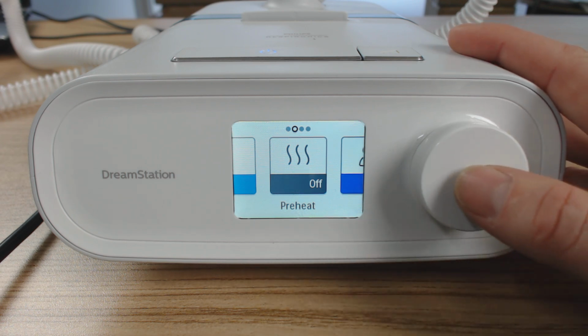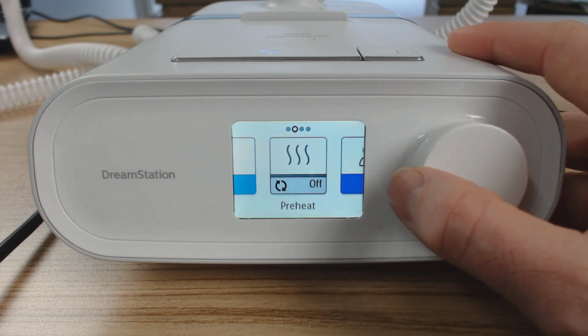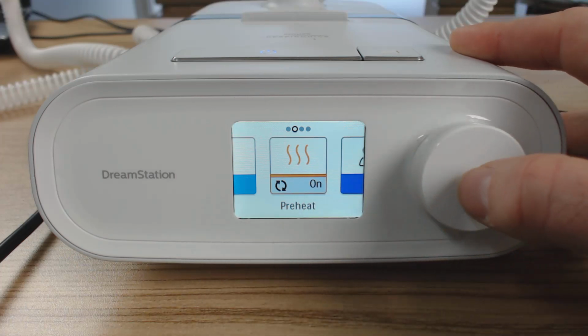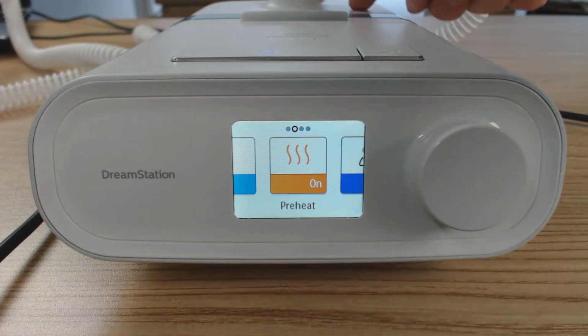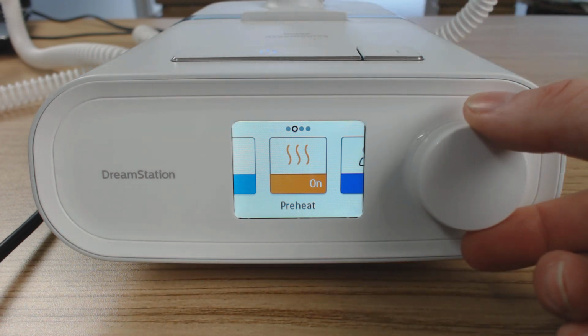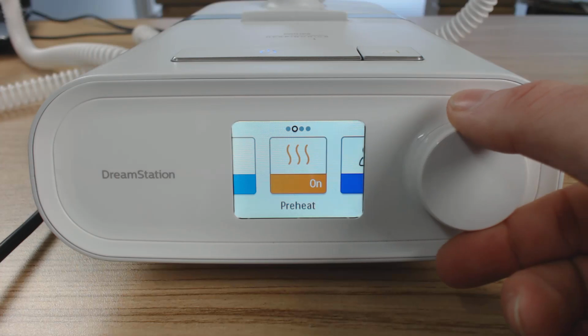So what we do with this, we just click the button in, rotate clockwise, and it goes from off to on, and then we just press in again, and now preheat's on. So it's going to preheat the humidification chamber at the back. Okay, but now we're going to rotate one to the right again.